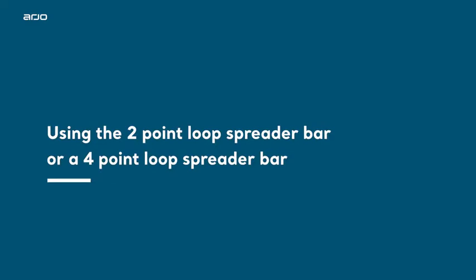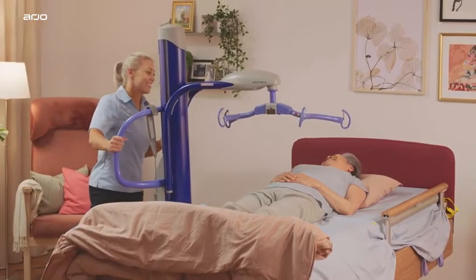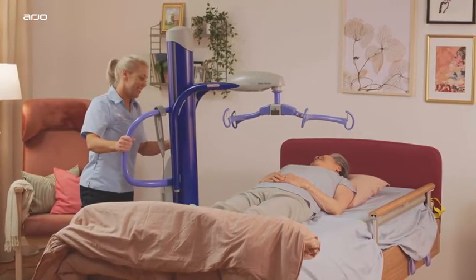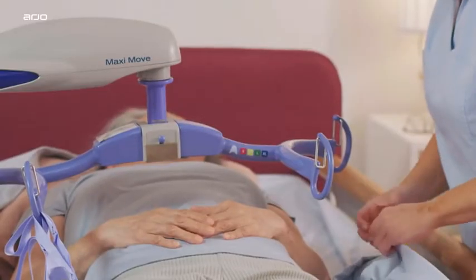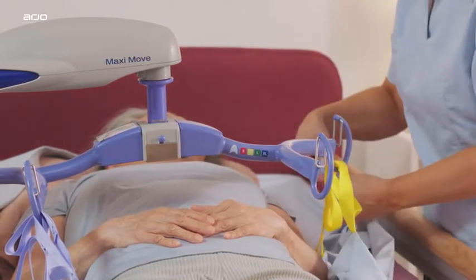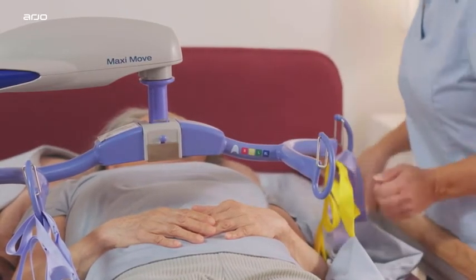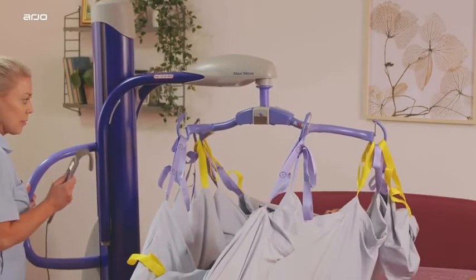Using a 2-point loop spreader bar or a 4-point loop spreader bar: if your MaxiMove has a loop spreader bar, ensure that the spreader bar is rotated into position before attaching the sling. When attaching a loop sling to the loop spreader bar, always ensure that the sling attachment loops are installed correctly into the retaining hooks. Use Arjo Loop Slings with the loop spreader bar.